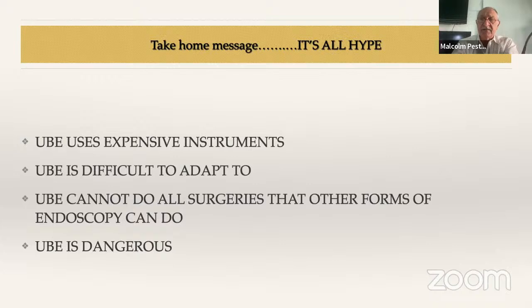That is the difference. The access may be small, 7 millimeters or 2 cuts of 7 millimeters. Doesn't really matter, brother. What matters is what you can maximally achieve inside, like sublaminar decompressions. So many things which I feel UBE has a much greater advantage on. But then everyone has their perspectives.